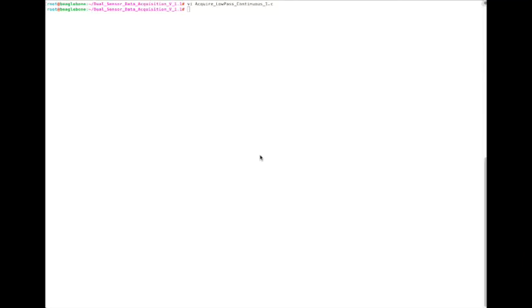In the beginning, the motion data output files produced by the dual sensor data acquisition version 1.1 did not include timestamps. So the C file, acquire low-pass continuous 1.c, was edited to include a timestamp in the motion data output files. Here I will demonstrate that edit.